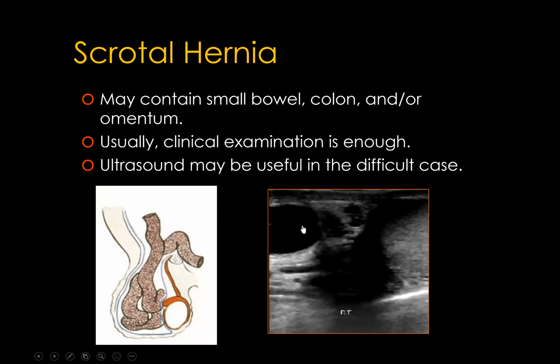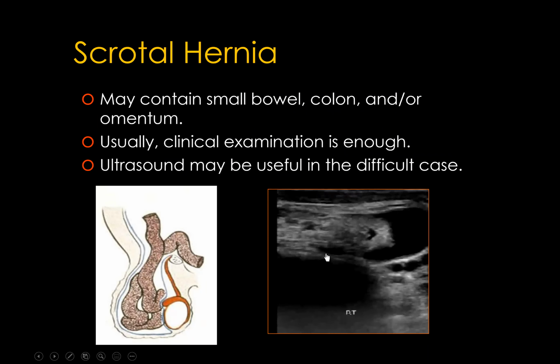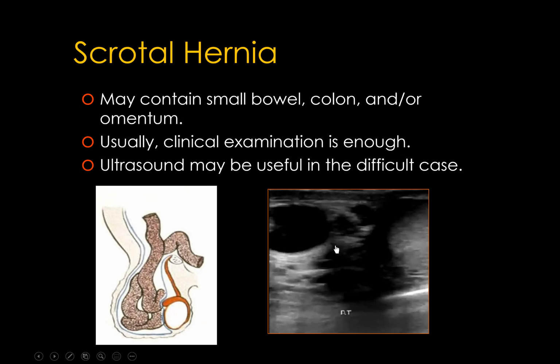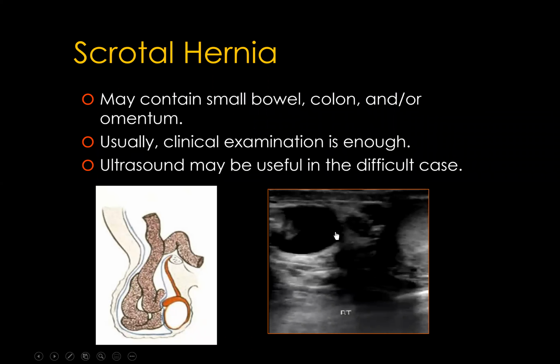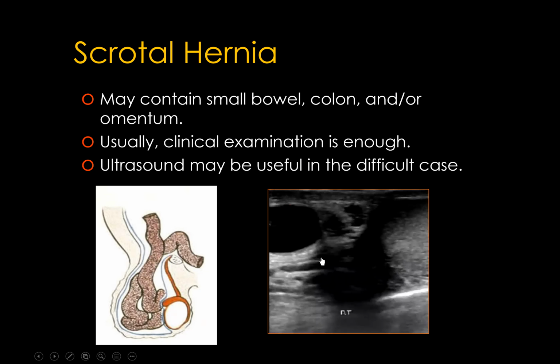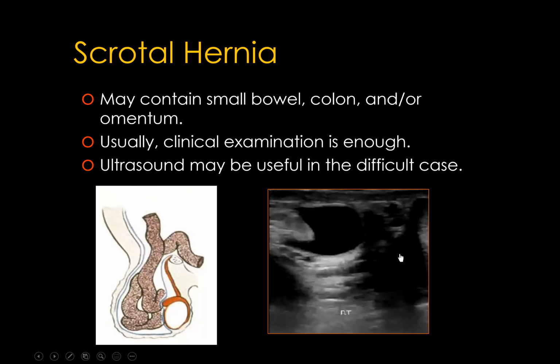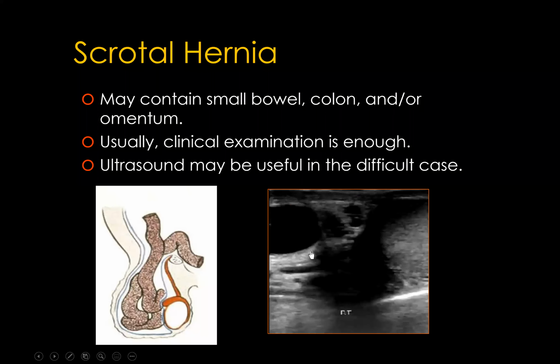In this clip, you see here the intestine with the peristalsis, and there is a fluid. Look again, this is the intestine with peristalsis, surrounded by a fluid. You see this peristalsis in the area of the scrotum, then you recognize this is scrotal hernia.